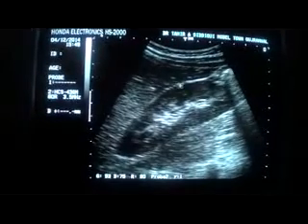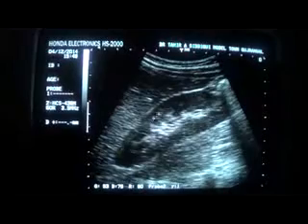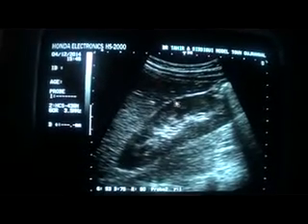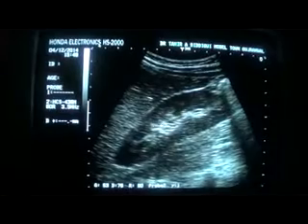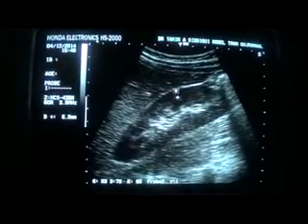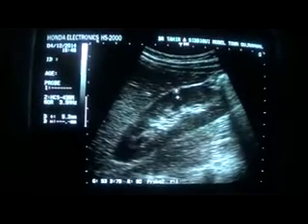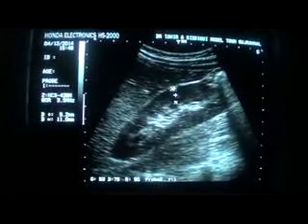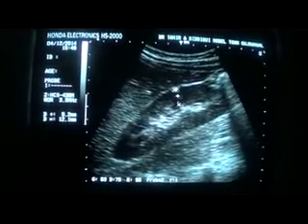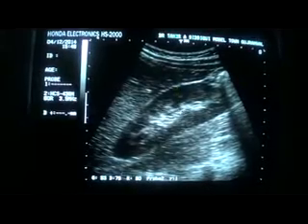Now the cortex, this area, so it is a strip. This area is the cortex, and these are the medulla. Now, for cortical thickness 5.2, for parenchymal thickness you have to include the pyramid with it, 12.1. So the cortical and parenchymal thickness is intact.